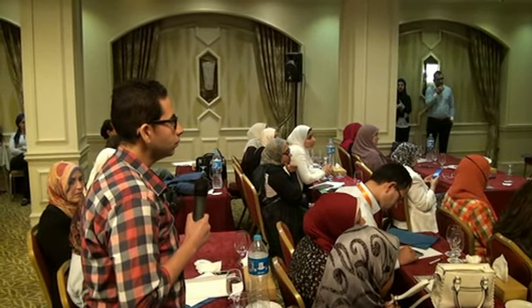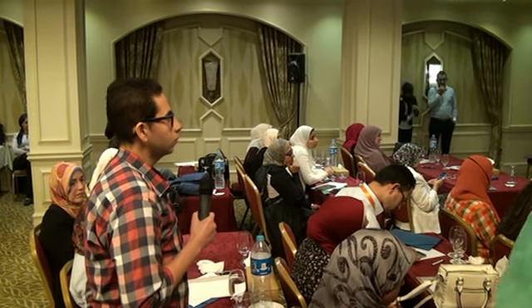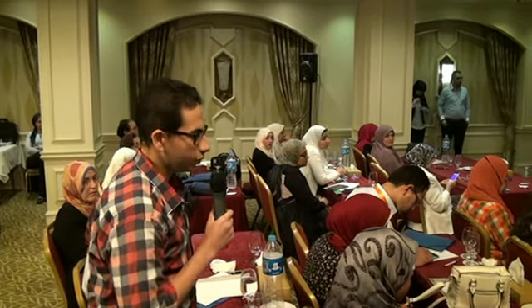But once it gets to like 1, 2, 3 millimeters of mercury, that's when we would say, okay, we have to figure something out, because the CO2 ventilation is inefficient. Yeah. Thank you so much.